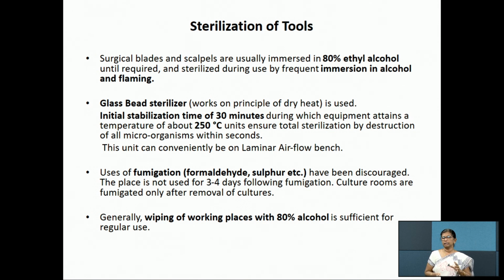These are the techniques which have to be followed for sterilization of all the tools. That's all about the culture media preparation, culture conditions, as well as the sterilization techniques.